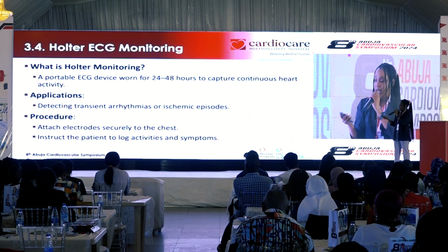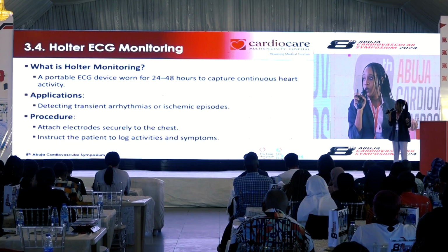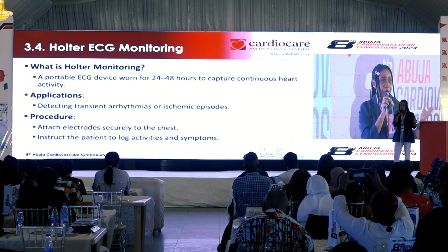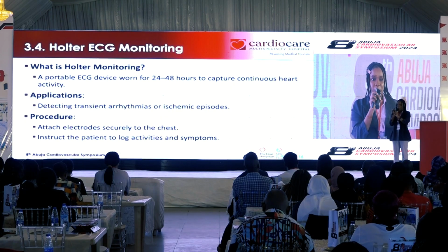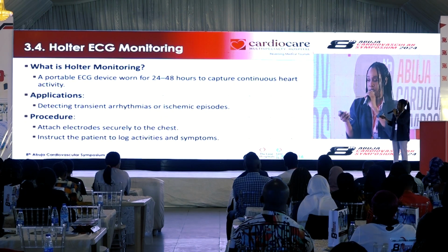Okay, and it's very important that after you fix it, you give your patients a diary so that they can document whatever they felt at a particular time. So once they're reporting, and you say, oh, there was a particular time I had a series of palpitations, they documented in their diary, this was what happened, this is how I felt at a particular time.